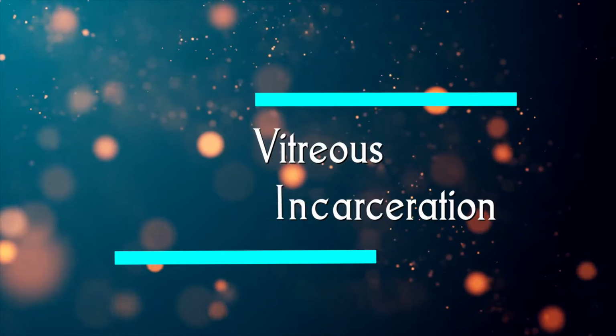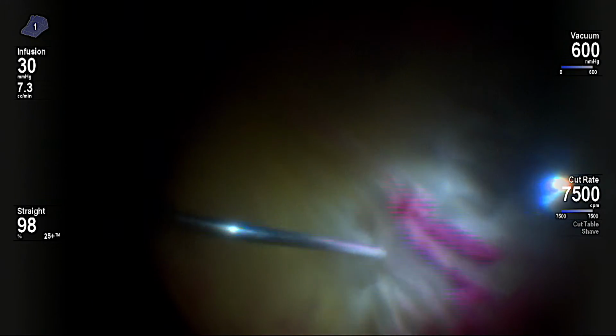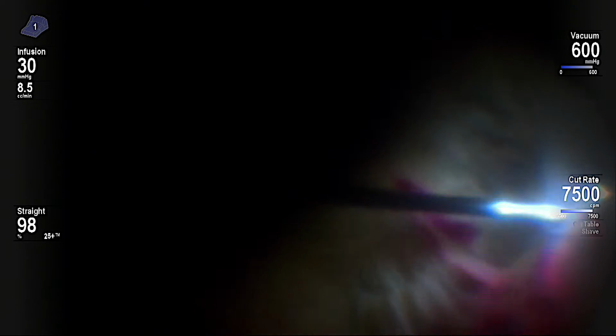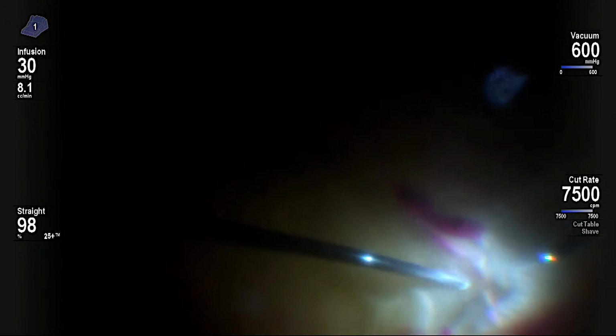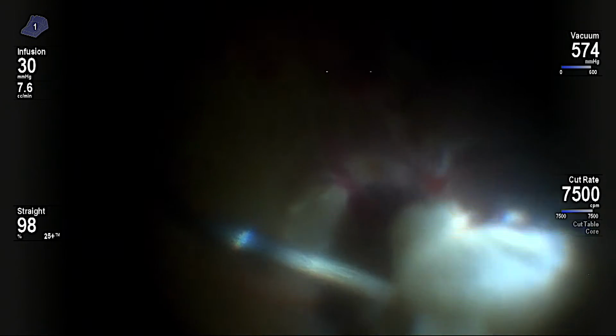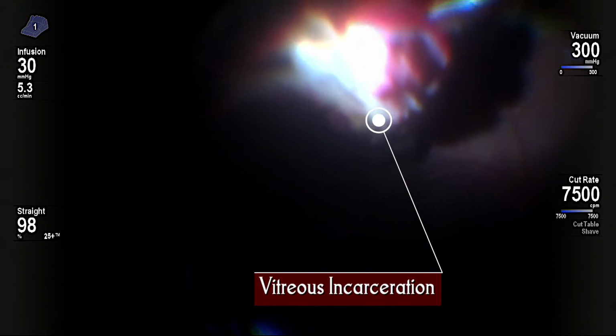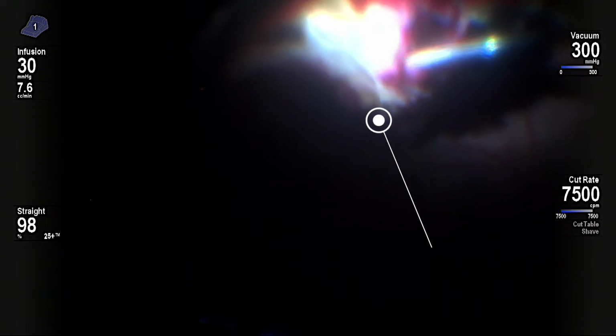A 56-year-old female patient presenting with trauma with an elastic cloth line. In this patient, the scleral rupture repair was done earlier. While doing the surgery, vitrectomy was done. And after clearing the vitreous hemorrhage, vitreous incarceration was seen in the supertemporal quadrant along with retinal incarceration.